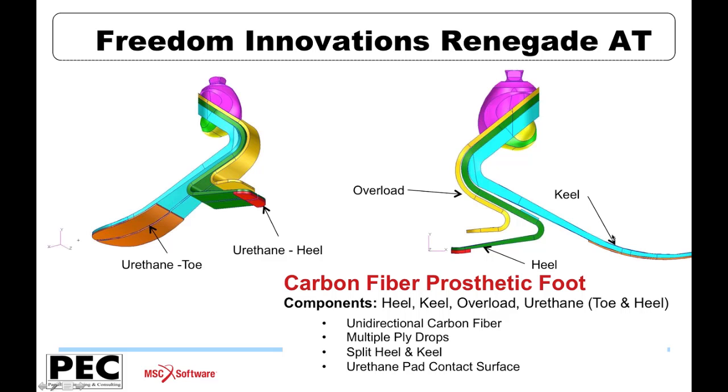And this is accomplished through progressive dropping of individual plies. This keel has something over 100 plies in it, and they're progressively dropped to thin or taper the cross-section of the component. The other component that we'll focus on primarily in the analyses that I'm presenting today is the one shown in green here, the heel component. And that's back at the back, as you might guess. And this particular design has what's referred to as an overload component. Basically, it's a travel limiter, and to try to prevent overload of the heel, so to provide contact and an additional amount of stiffness and restraint against excessive deformation of the heel.